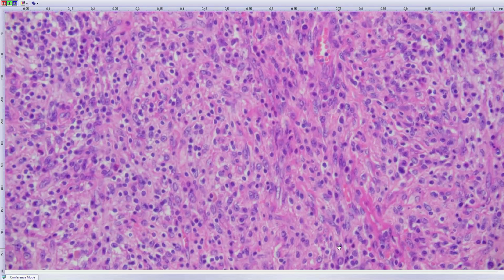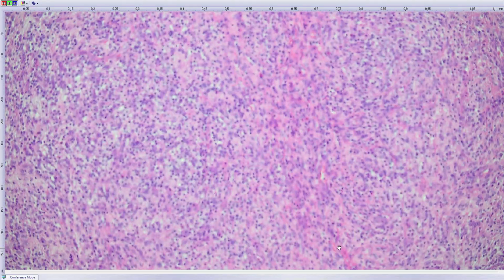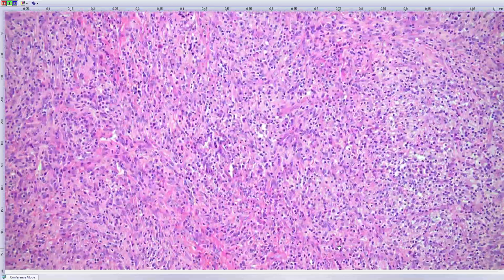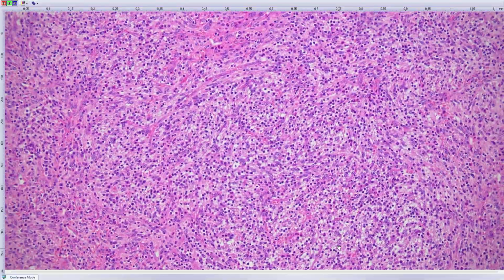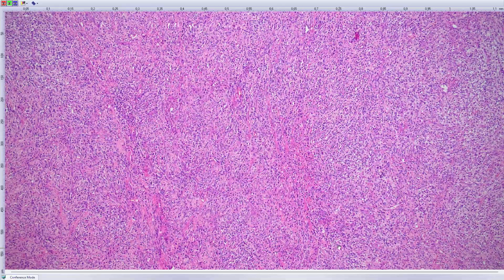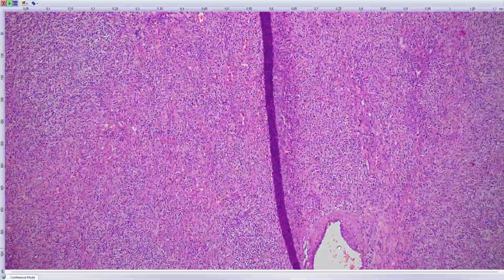And overall, I mean, it doesn't look benign, but it doesn't look like an undifferentiated spindle cell sarcoma. I saw the punch biopsy, they sent it to me eventually, and there was like half of the punch was necrosis. So I don't blame them calling that undifferentiated sarcoma because it was really tough material. But from this resection, first thing I considered, anybody would have a suggestion in this location with this morphology?